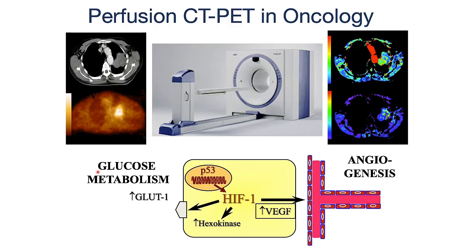So, for example, we could use PET-CT combined with perfusion CT to get multimodality imaging of, in this case, lung cancer structure, the glucose metabolism, and using the CT for the blood flow. And we can even derive combined images. This is here the relationship between glucose metabolism and blood flow, an image that was created by a former Lowenthal lecturer, Matthew Griffiths.